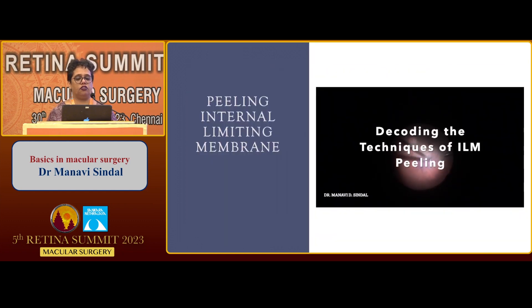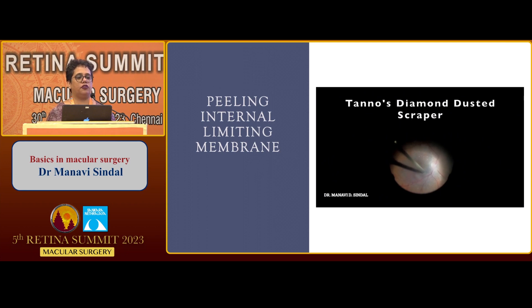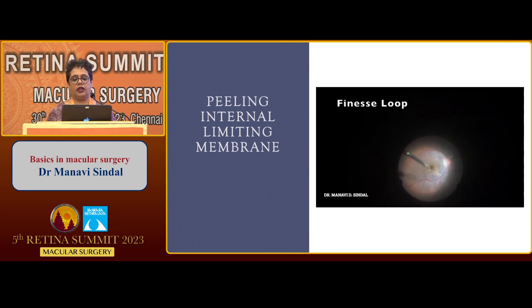Coming to internal limiting membrane peeling, which is a vital step in macular hole surgeries. The most common way to initiate this peel is by the pinch-and-peel technique, wherein we give a very superficial pinch to the superficial layers of the retina to get a layer of the ILM up and then proceed by peeling this membrane. The new sharkskin forceps introduced by Alcon make this even easier and atraumatic. As we peel the ILM, we should grasp it near the base and keep lifting the flap further. The initiation of the ILM peel can also be done by a Tano's diamond-dusted forceps scraper, and then this edge of ILM can be further lifted and the peel extended by the ILM forceps. The Finesse loop is also a very nice, atraumatic instrument — very good for initiating a peel, especially for beginner surgeons, and also useful in eyes with a sticky ILM or in eyes with retinal detachment.